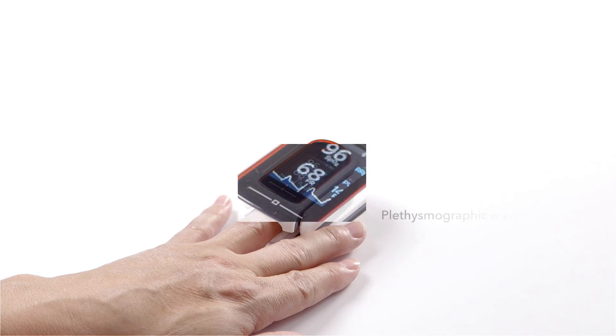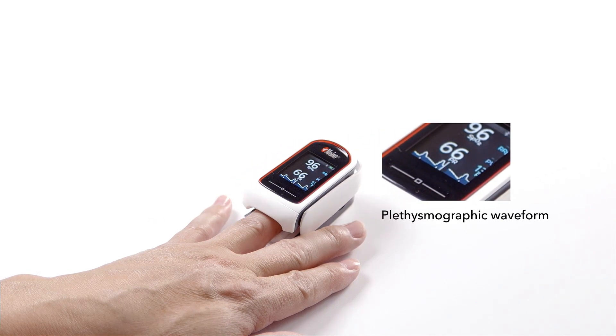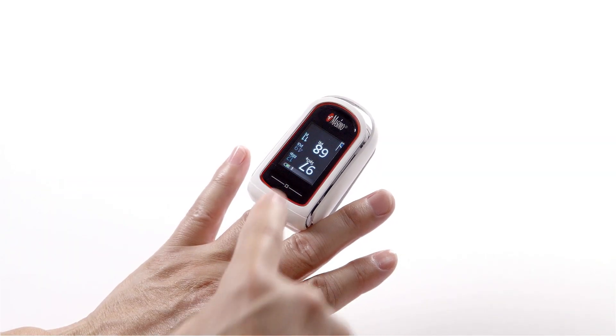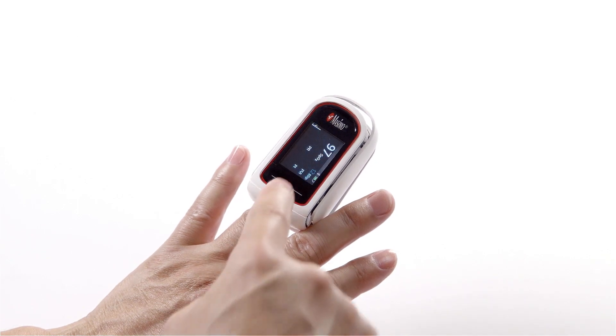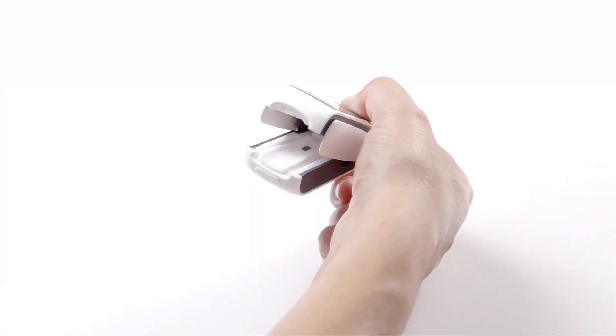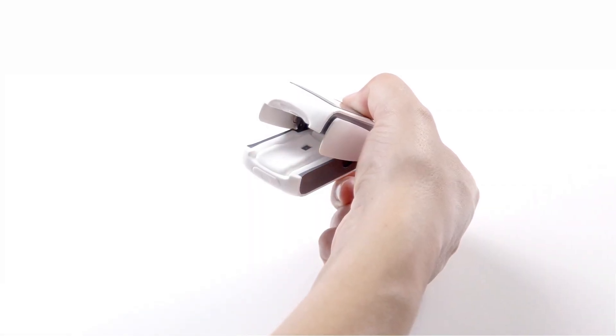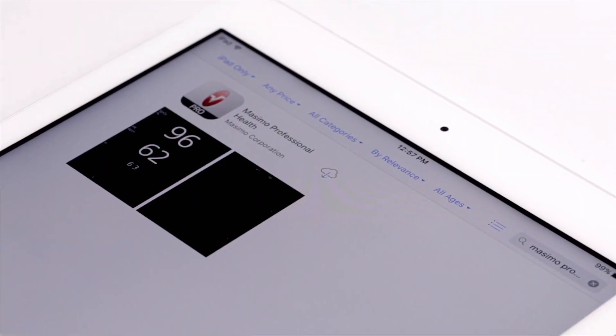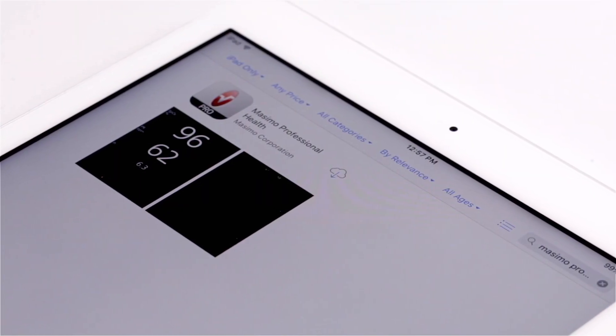MidiSat RX is designed for performance, featuring a plethysmographic waveform, a high-resolution display with a rotating and adjustable color screen, a unique silicone finger grip for secure placement and enhanced comfort, and a free downloadable Massimo Professional Health app with trend and sharing capabilities.